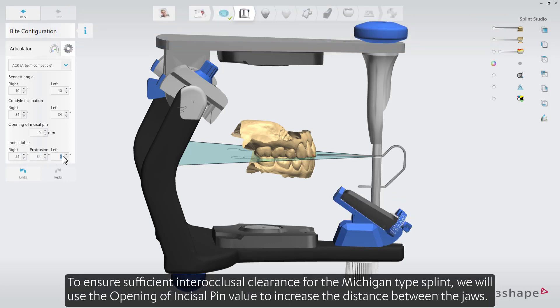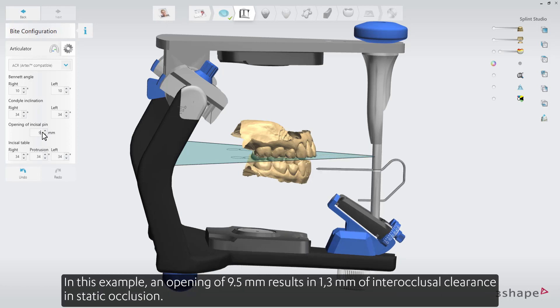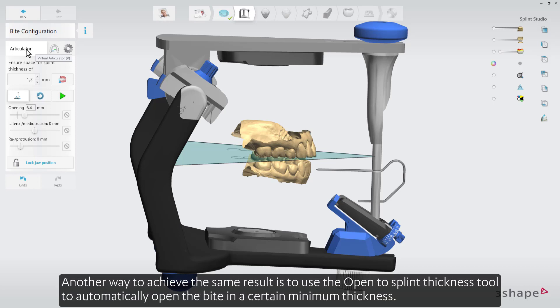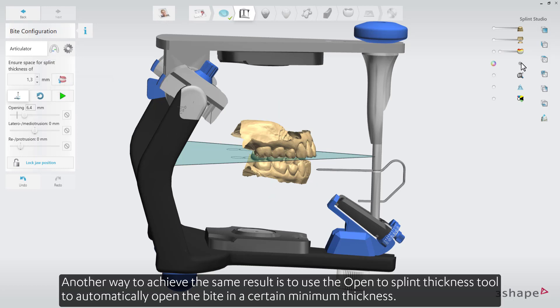To ensure sufficient interocclusal clearance for the Michigan type splint, we will use the opening of incisal pin value to increase the distance between the jaws. In this example, an opening of 9.5 millimeters results in 1.3 millimeters of interocclusal clearance in static occlusion. Another way to achieve the same result is to use the Open to Splint Thickness tool to automatically open the bite to a certain minimum thickness.